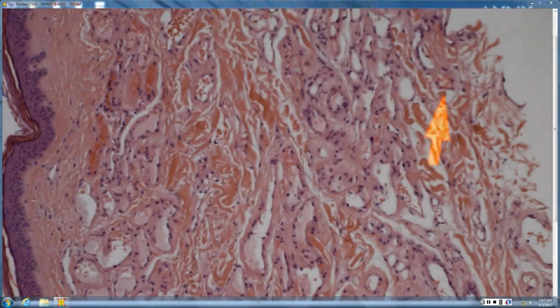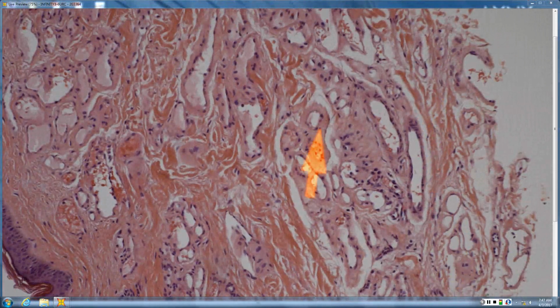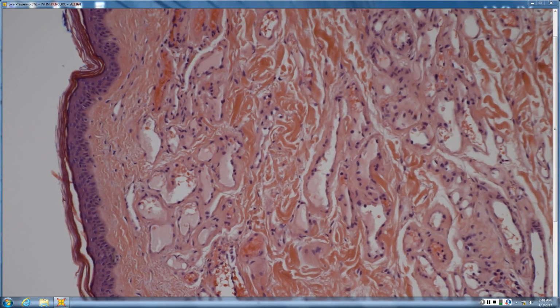This one has lots and lots of little superficial capillary-sized vessels. Are the walls thin or thick and pink? Thick and pink. Why would they be so thick and pink? Maybe because it's been around a long, long time. Yes. So what's a little bump made of capillary vessels with thick hyalinized walls? Like a cherry angioma. So cherry angioma, De Morgan spot, sits around for years and years, and the vessels become thick and hyalinized. So small vessels, but the walls are thick and hyalinized. That's characteristic.